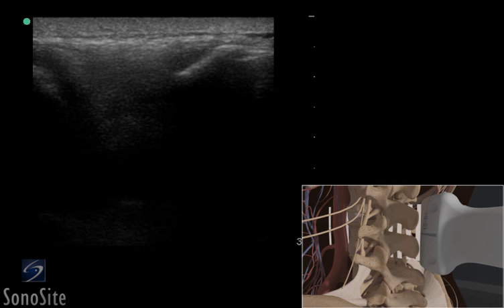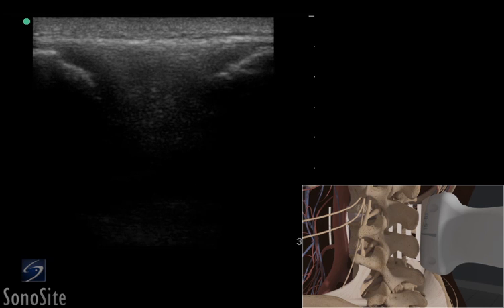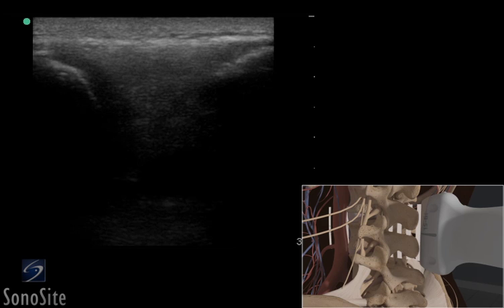The two previously identified spinous processes will now appear as crescent-shaped, concave, hyperechoic structures. The gap between the bright hyperechoic convexities is the interspinous space and defines the area in which the lumbar puncture should be performed.